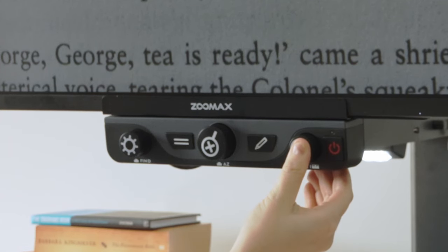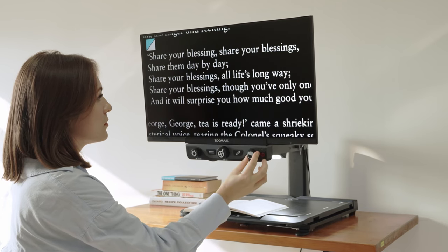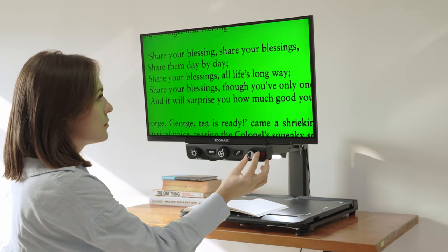Long-press the Color Mode button to switch to full color mode. More high-contrast colors allow users with low vision to see and read without putting additional strain on their eyes. An additional 21 high-contrast colors are available.